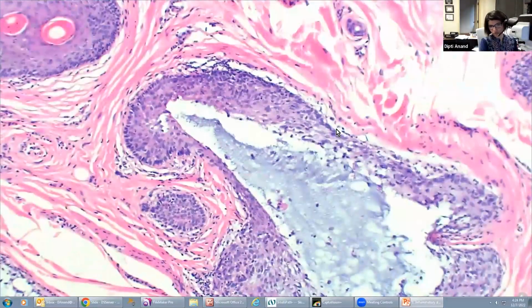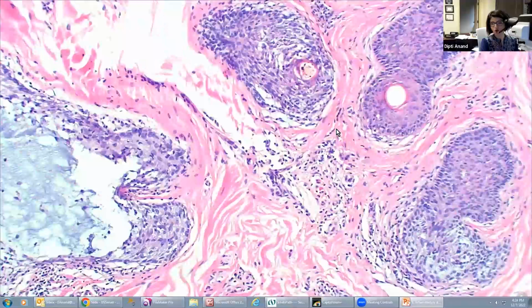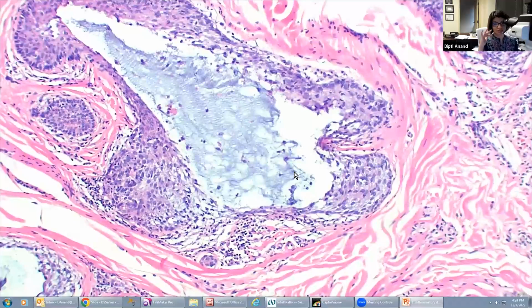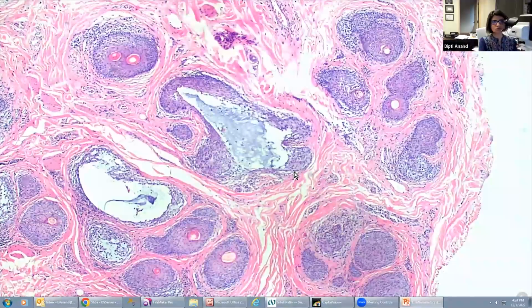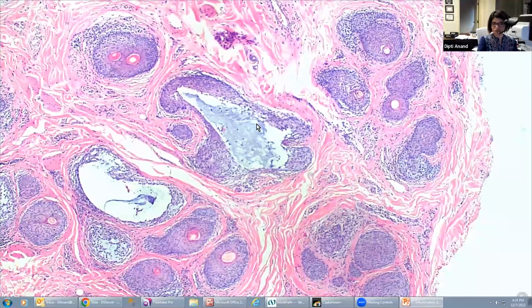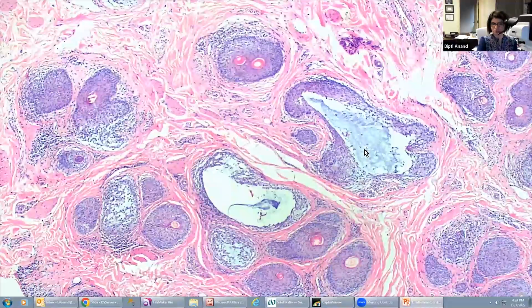That's follicular mucinosis. And always remember that in follicular mucinosis, you may get a lot of eosinophils. So the background may have a lot of eos. That is completely fine for follicular mucinosis. In fact, the presence of eos is fine for any T-cell lymphoma. So you do not want to pick up something like an arthropod bite with mucin deposition because you're seeing the eos. If you see mucin in hair follicles, that's follicular mucinosis. You get it? You can see all these nice hair follicles with mucinous degeneration of the follicular epithelium.